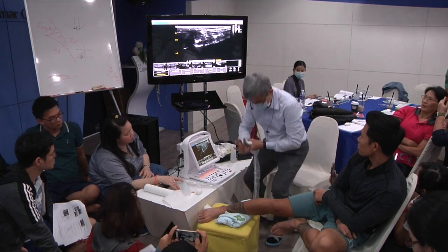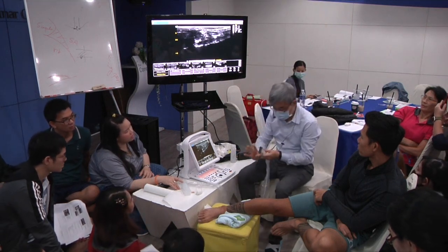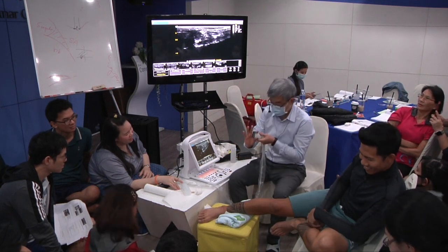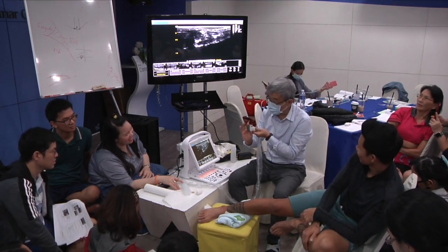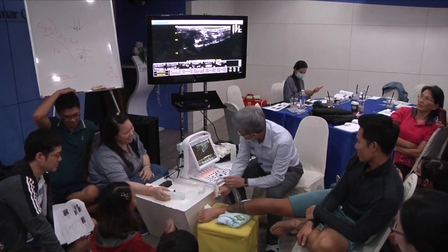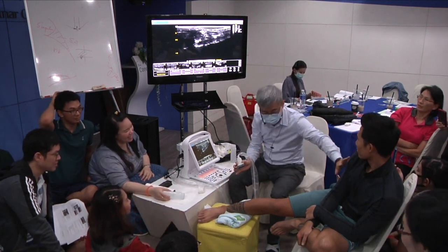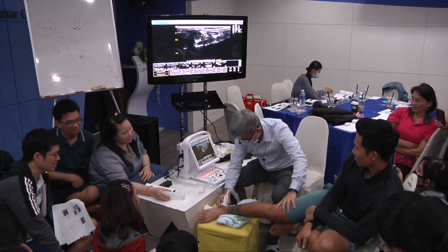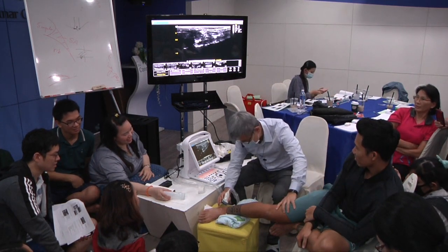PITFL, easy. No, not easy. This is a little bit difficult. I think it's very difficult. No, I'll show you.